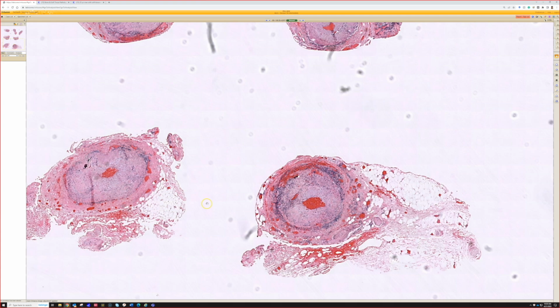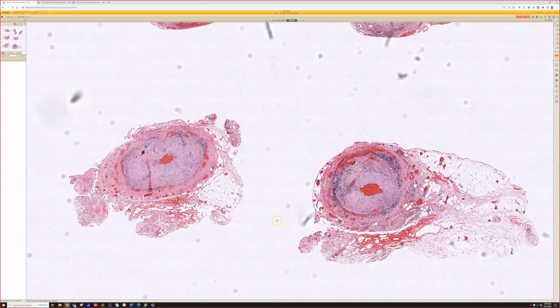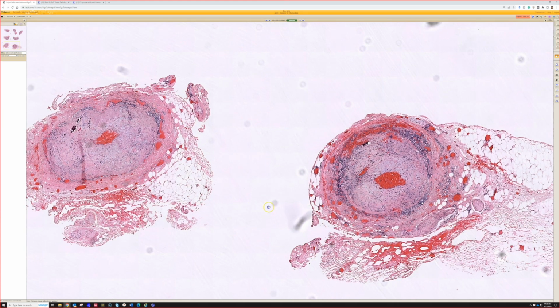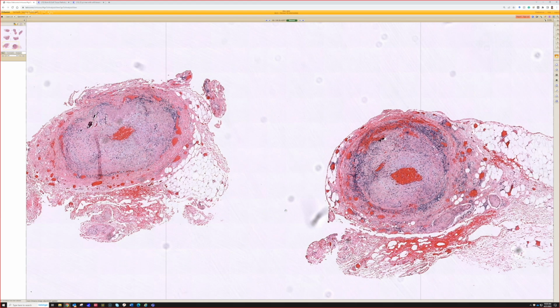And then we hunt diligently for temporal arteritis, and we often do not find it, as Dr. Pitch very nicely pointed out. These are sometimes frustrating and agonizing specimens because they take a long time looking very carefully. But not this one, huh?